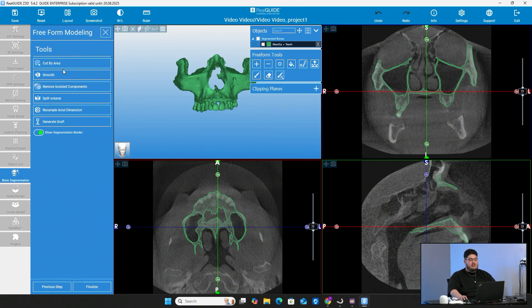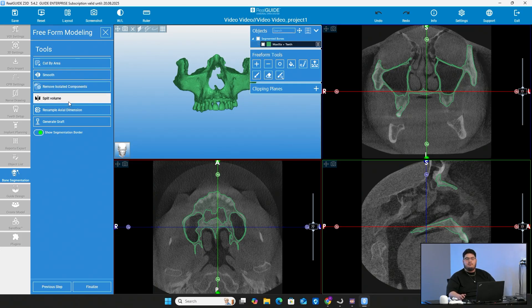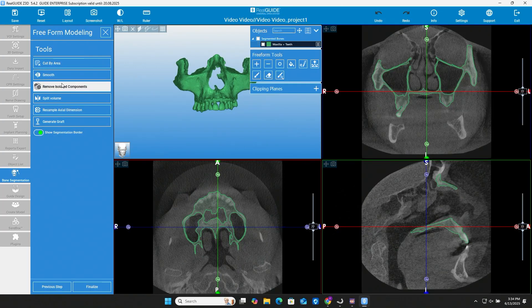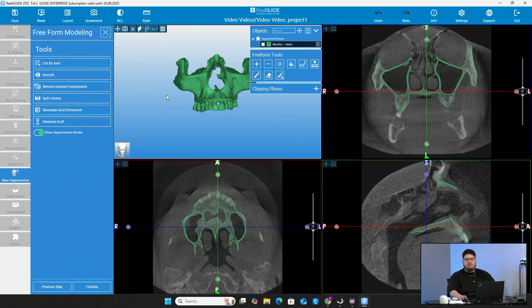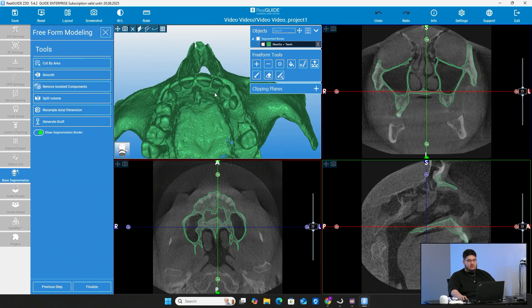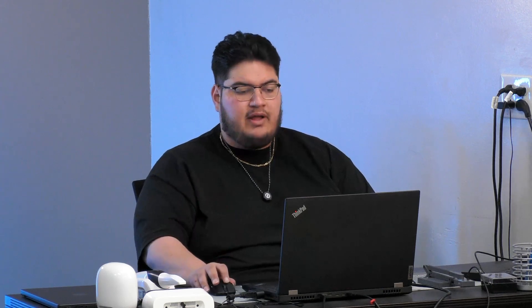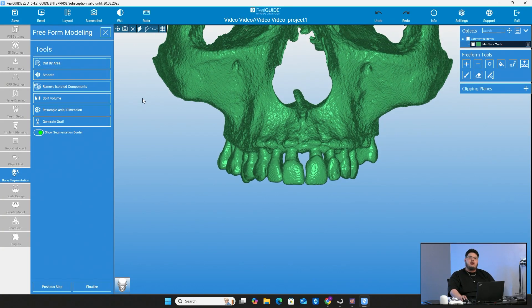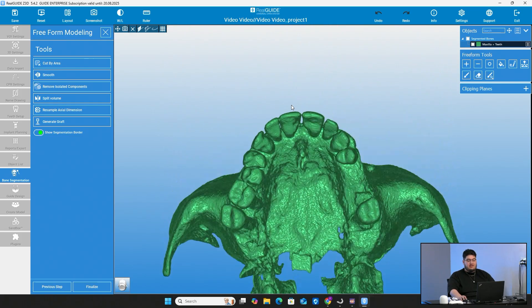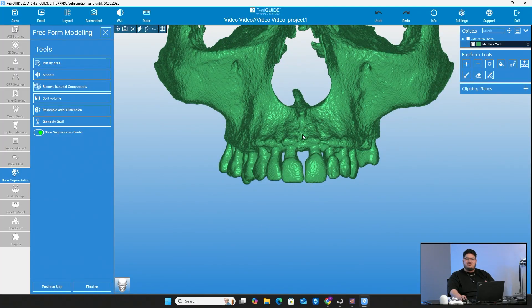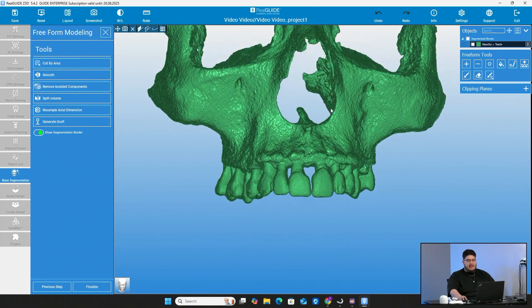You'll see you have different options to start editing this jaw scan. You can cut the area, smooth it, or remove isolated components — so if there's any floating material, you can go ahead and get rid of it. The software does a really good job of not leaving stray material. It's really good at capturing just the bone and making sure you have just the jaw scan, because with CT scans comes scatter from dense and less dense areas. But the software is very good at picking that up. So realistically, I don't do much after this step.